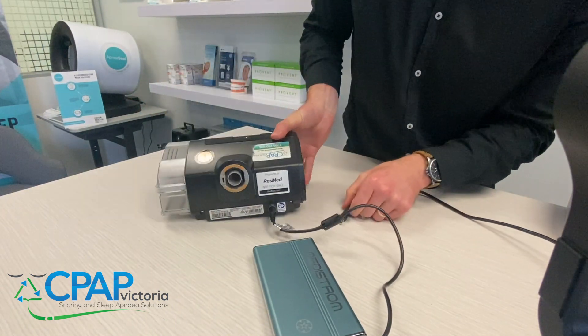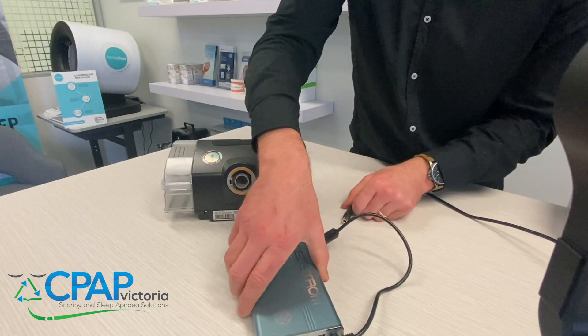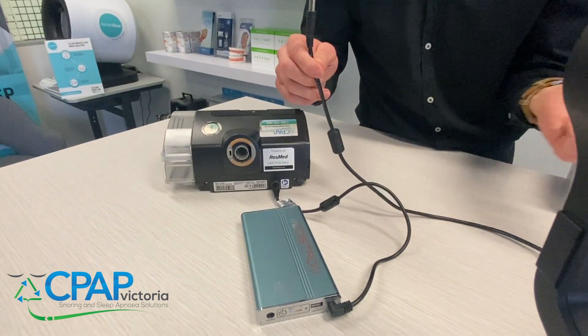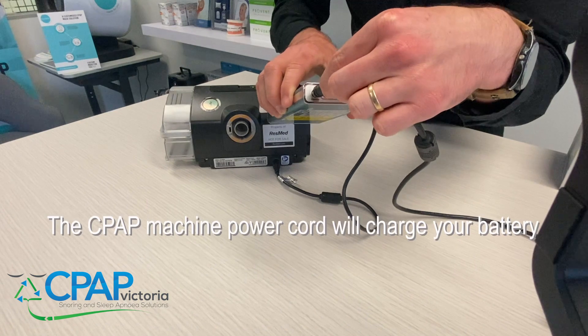Now if you want to use the battery as a backup source just in case your mains power goes down, all you have to do is grab your AirSense 10 PSU cord, plug that into the wall, and then plug it into the back of the battery where the charging port is.